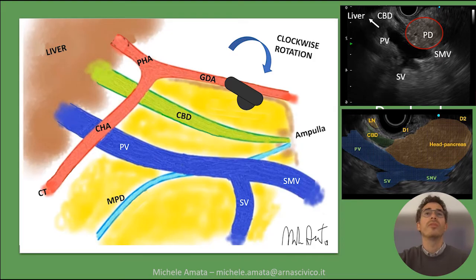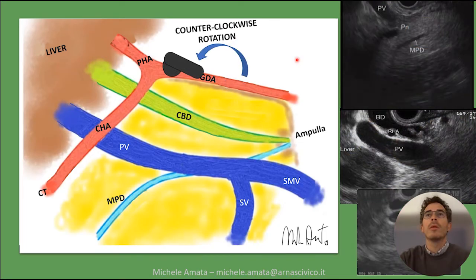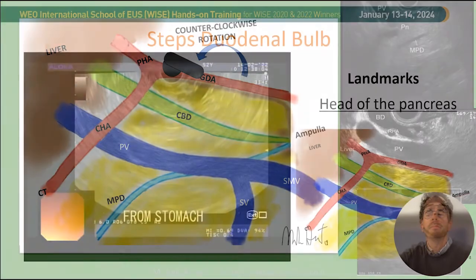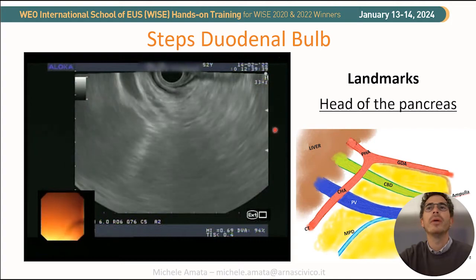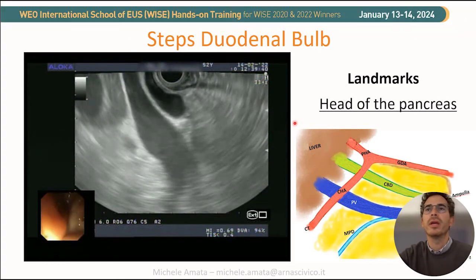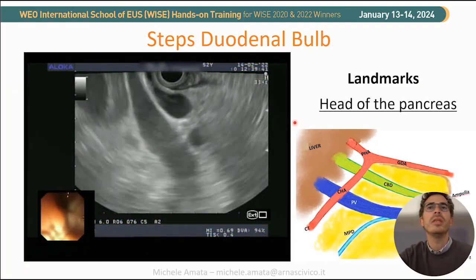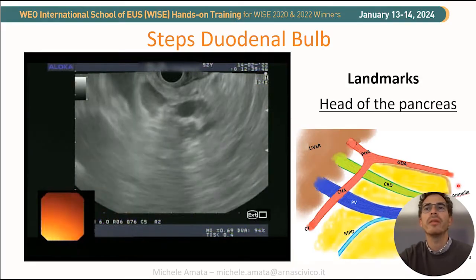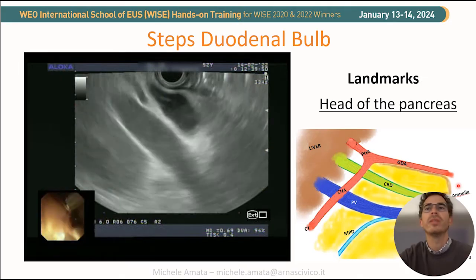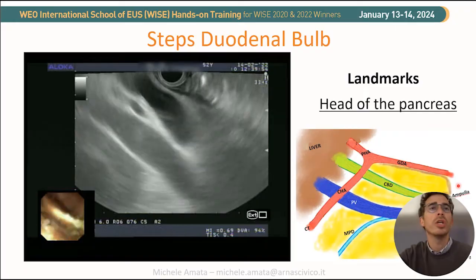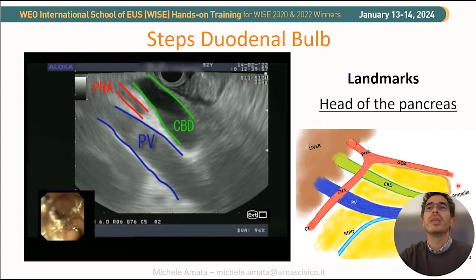With clockwise rotation, we move distally to the major papilla with full visualization of the CBD and the MPD. By torquing counterclockwise and adding a soft upward movement, we move to the hepatic hilum and to the intrahepatic ducts. Endoscopically, we push the scope down through the pylorus, look at the apex of the bulb, and switch to the US view. The first landmark is the portal vein, and the CBD is close to us. Torquing clockwise, we investigate the head of the pancreas and the Wirsung comes into view. Moving counterclockwise, we detect the inferior vena cava. Torquing counterclockwise, we go to the hepatic hilum and the bile duct comes into view. We visualize the portal triad and measure the CBD, which in this clinical case is 13 mm.